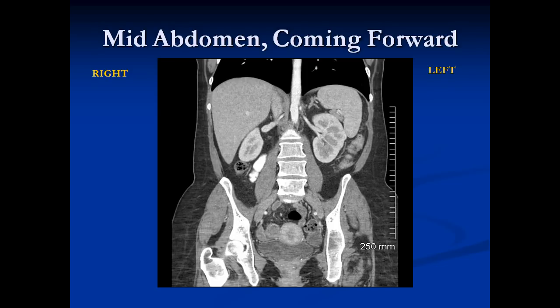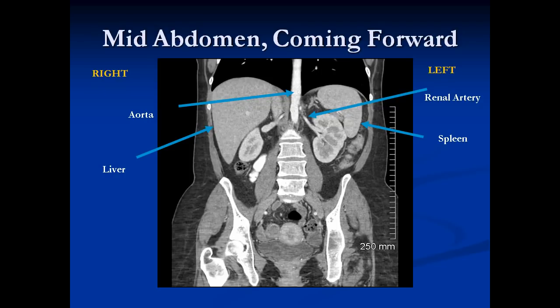Moving a little bit forward into the mid-abdomen, things change. Here we can see the aorta — a retroperitoneal structure sitting behind everything else. We can see the renal arteries going down from the aorta into the kidneys. There's the liver again, the spleen, and the psoas muscles on either side.